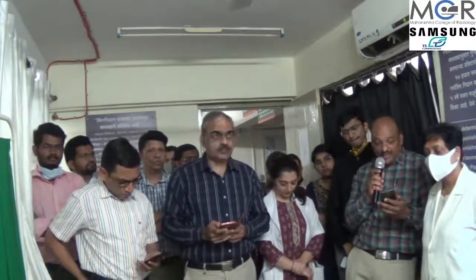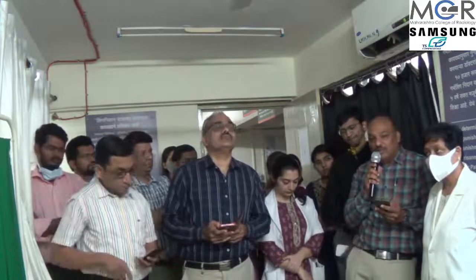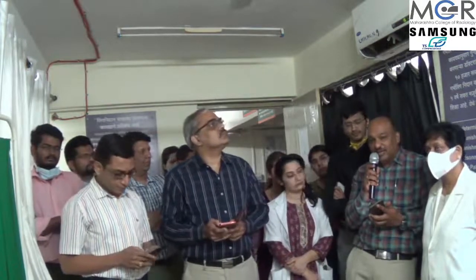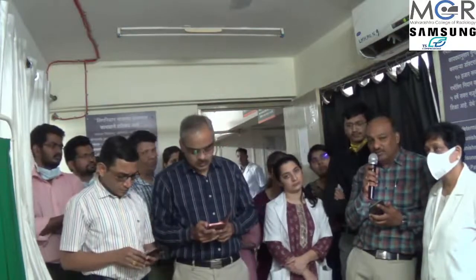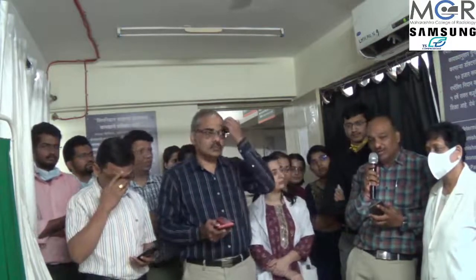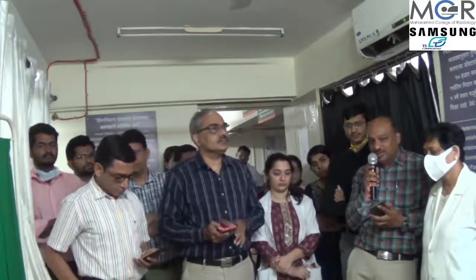For taking the endometrial volume, a few machines have endometrial volume assessment by 3D. In Voluson, there is endometrial volume estimation by the name of VOCAL. Every machine has a different setting to calculate the endometrial volume. High-end machines have this endometrial volume assessment, so you can make use of it.